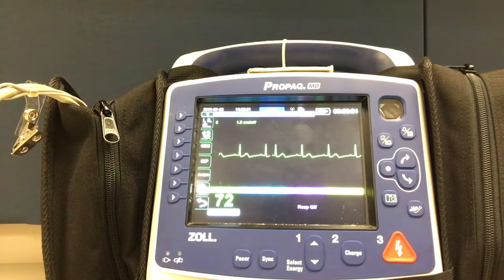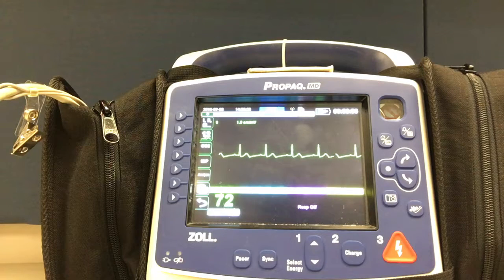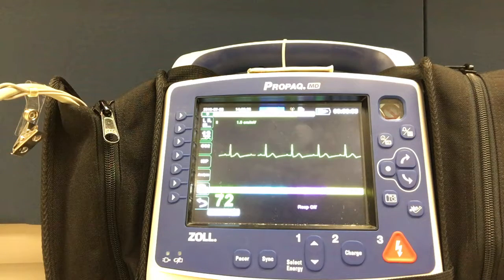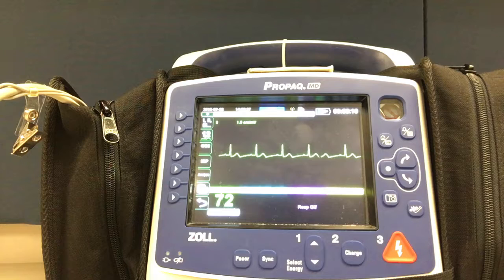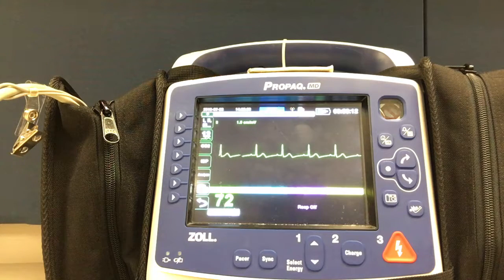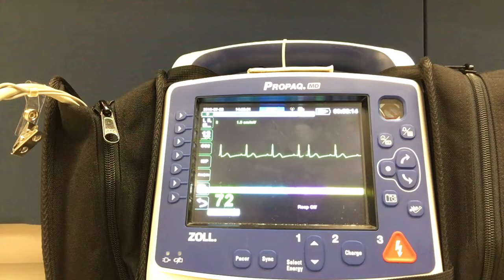In this video, we will show you how to obtain a 12-lead EKG using the ProPakMD. Prepare the patient for a 12-lead EKG by applying the required limb and precordial leads.